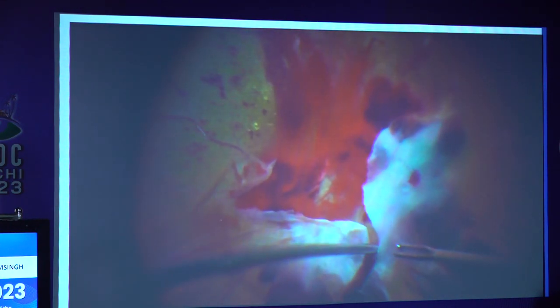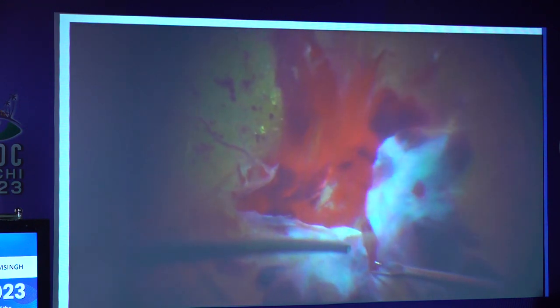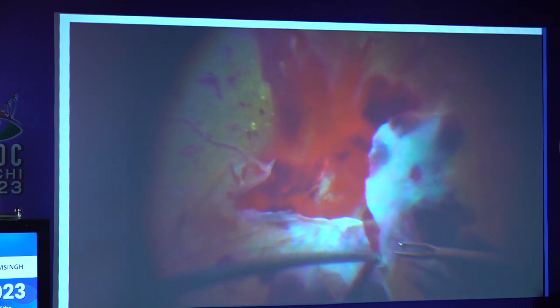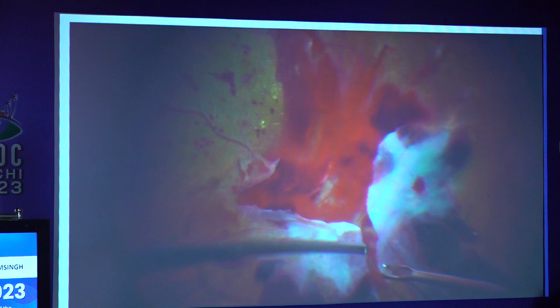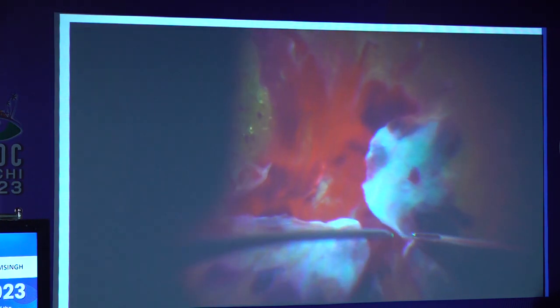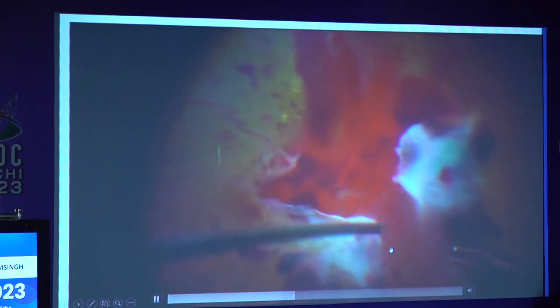Even when I am bimanual, I am not bimanual. It's something like people used to do with mask and seat belt. You have protection, but you are not using it. And you see what happens here after this. I just went with the flow and there was a tear. If I would have used forceps at this step, I would have easily avoided an iatrogenic tear.